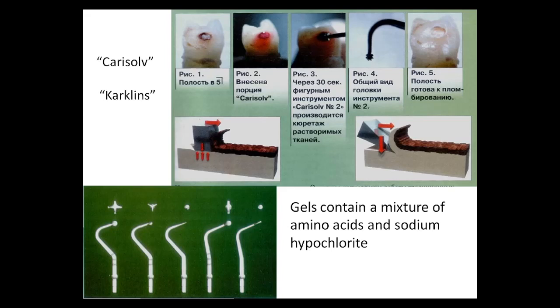This gel is applied into the caries cavity first, and after that we remove softened dentin using a special sharp instrument like an excavator, for example.